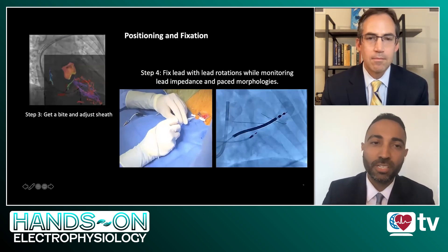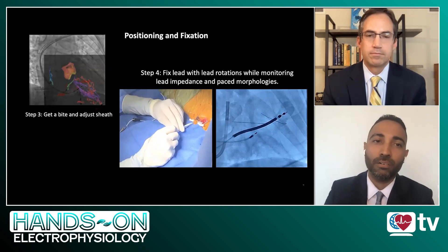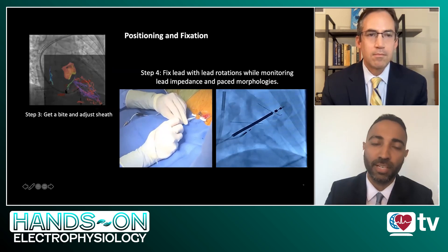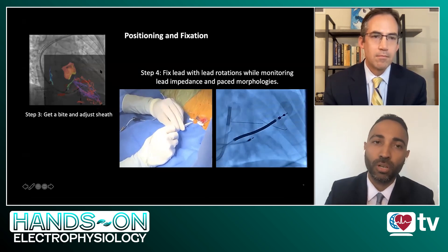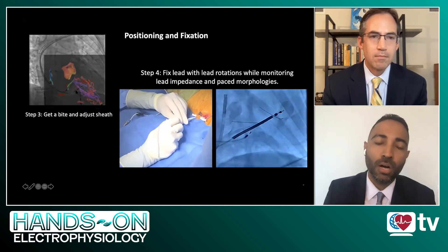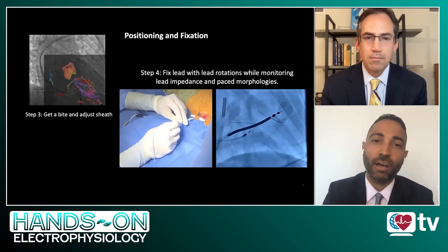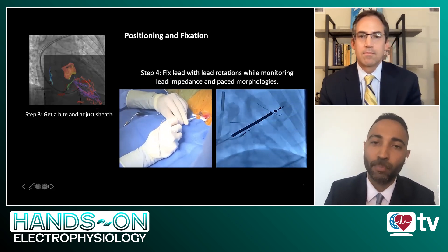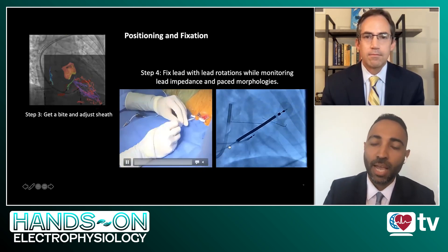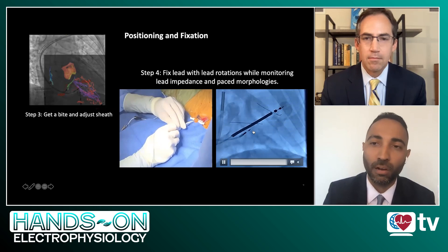Moving on to adjusting things — in step 3, it is very critical to adjust the angle. The angle at which the left bundle branch pacing lead is advanced through the septum is very different from the His bundle lead, and it is more towards a 2 o'clock position in an RAO projection. You then pull your sheath back so that there is no bunching forward between the sheath and the septum, and the sheath and the lead are aligned in one straight line. Then you start fixing the lead with rapid rotations, with rapidly rotating the lead with two hands, and fluoroscopically you see the advancement of the lead into the interventricular septum in an RAO projection.